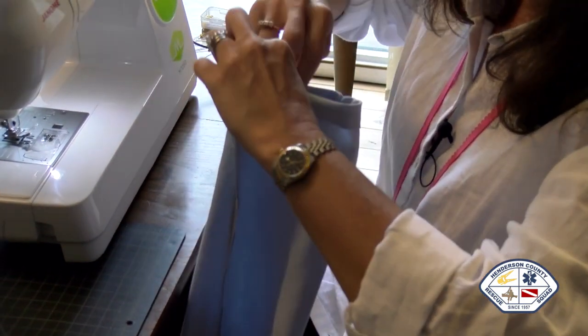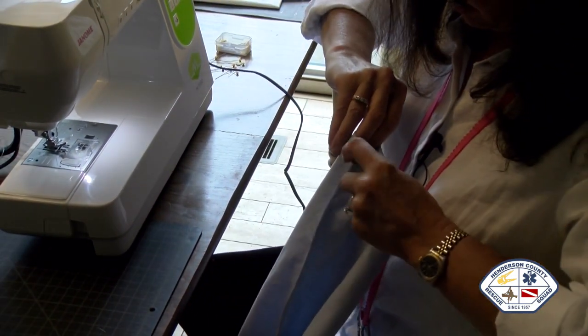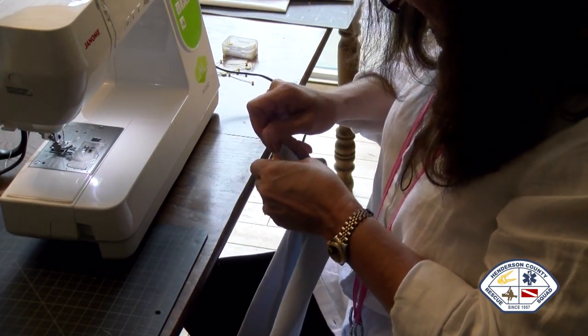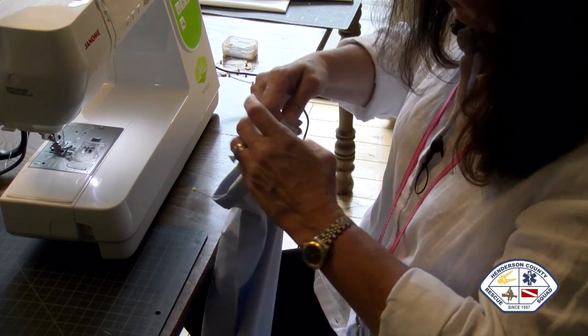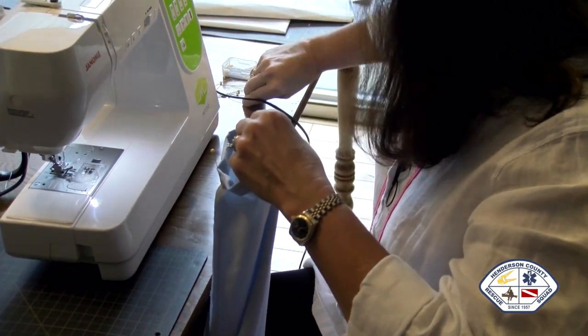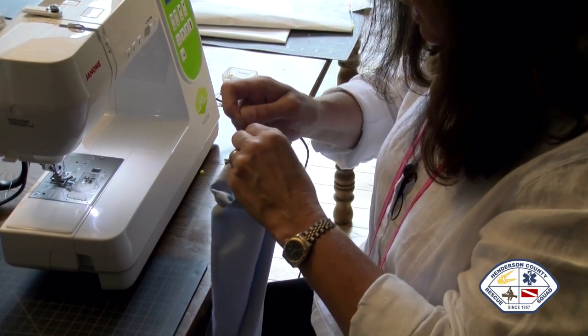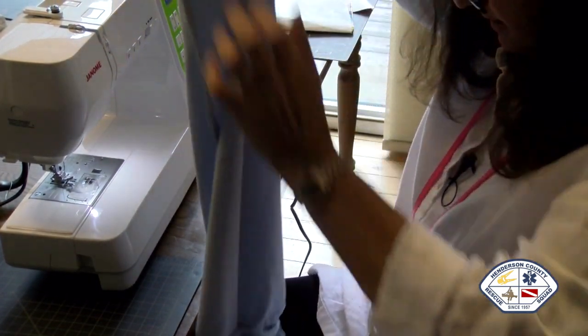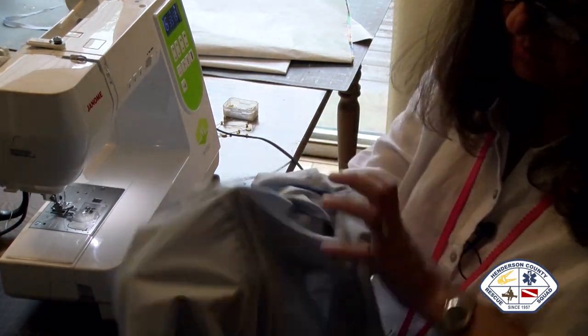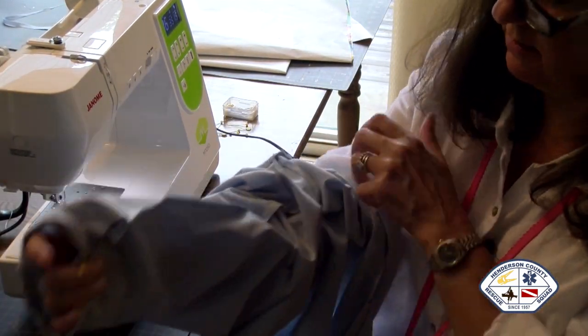So now we'll put a pin or 2 in there. I'm the worst. I don't love to put pins in things. I don't know why. I feel like it wastes my time sometimes. But if we're going to do it right, and they say I need to do it right, then we'll flip it right back out front.